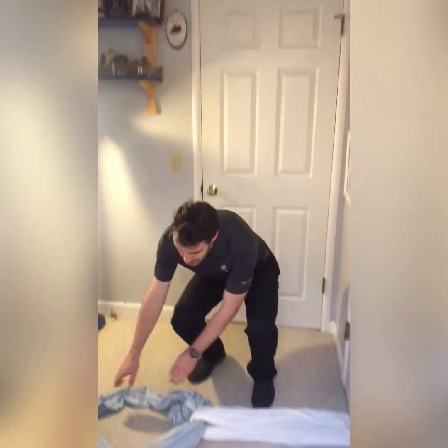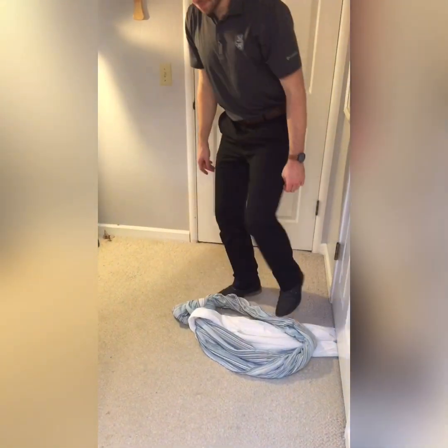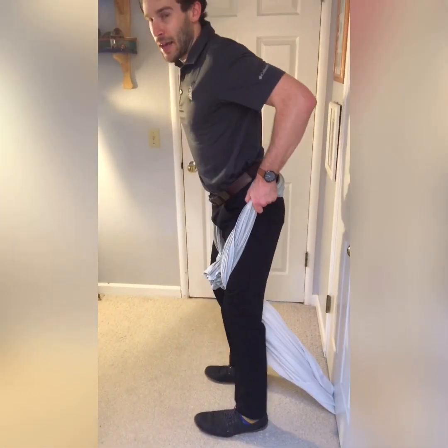There's another way that you can use the traction system. Simply take the loop and loop it back so it's over the first sheet that you put on. Next, put your feet between the 2 holes that this creates and slide the sheet up to the low back area. From there, go to your hands and knees and go forward until you feel some traction in your low back.